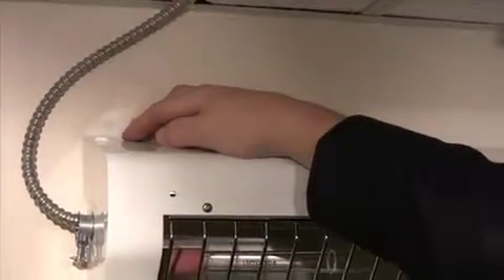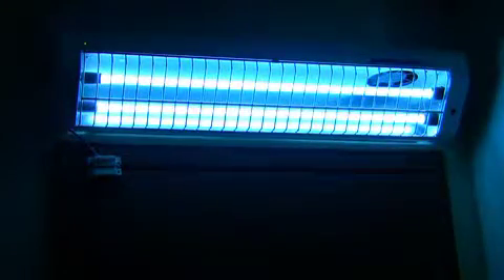Now turn the on/off switch on and a green LED will indicate that the unit is powered and ready to work. Please note that the unit senses when the room is empty and starts up, and when the door opens the unit will automatically shut off.